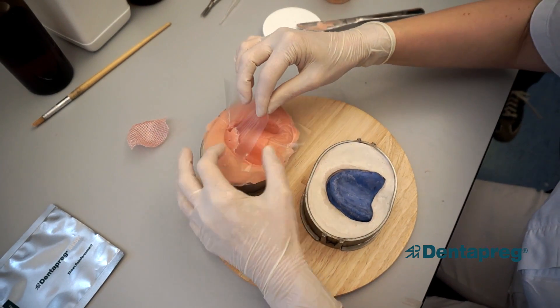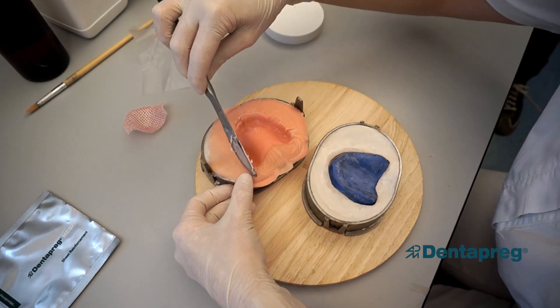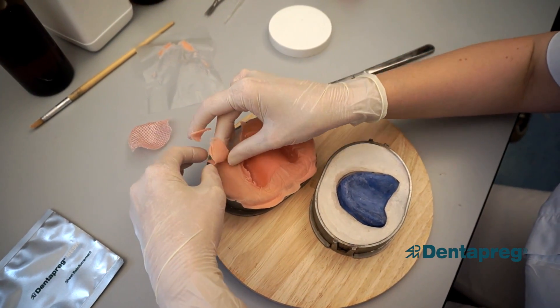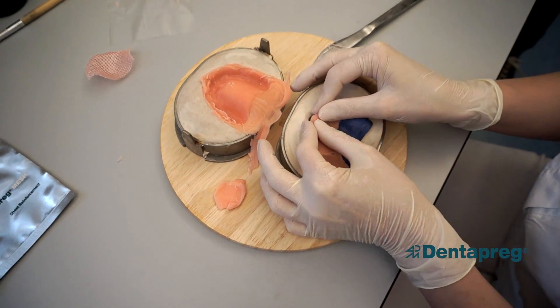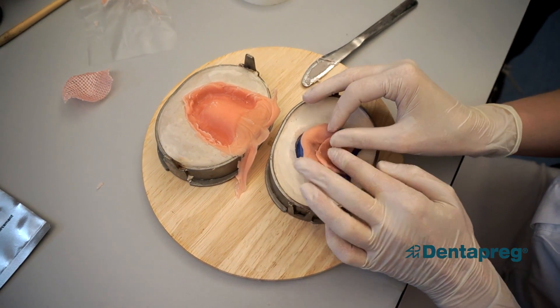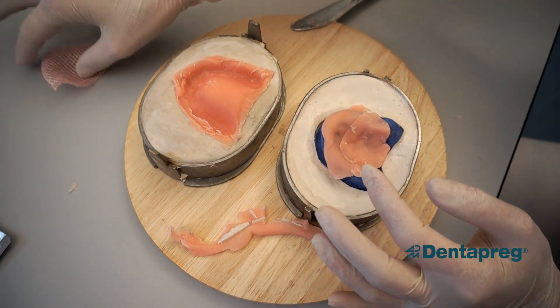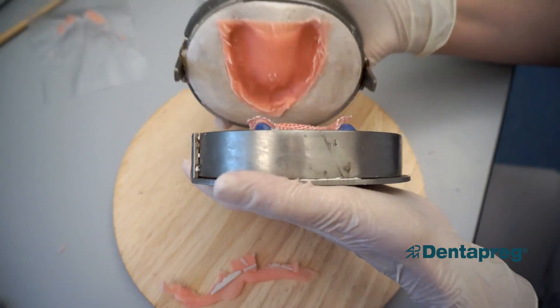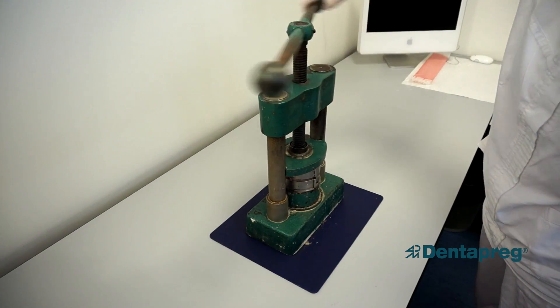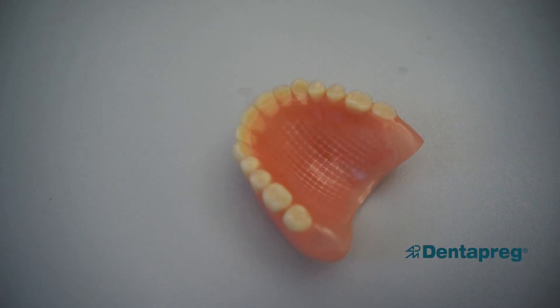Take the flask out of the press. Open it and remove the foil. Cover the stone model with a thin layer of acrylic. Place the shaped Dentepreg Mesh into this layer, making sure that the acrylic dough is spread under the whole surface of the mesh. Now close the flask again, put it under the press, and finish the denture in the usual manner.